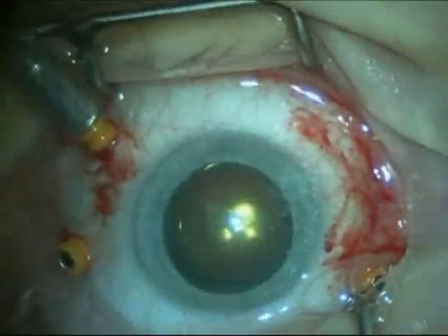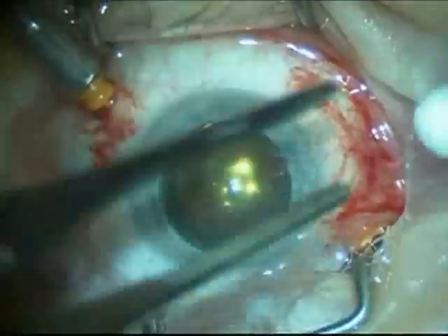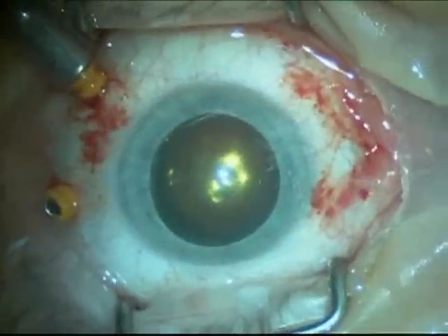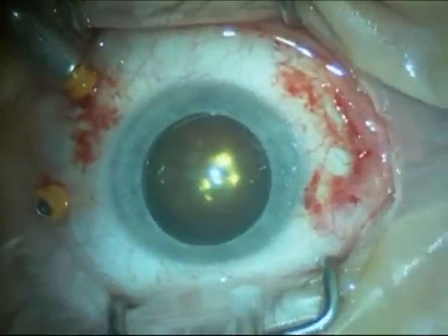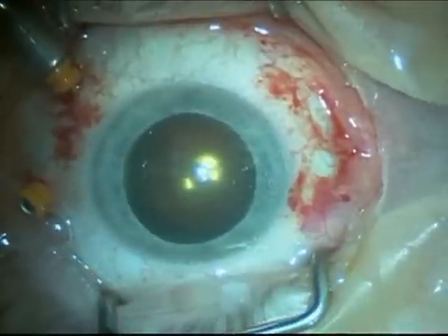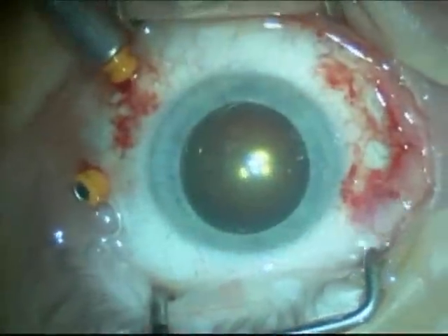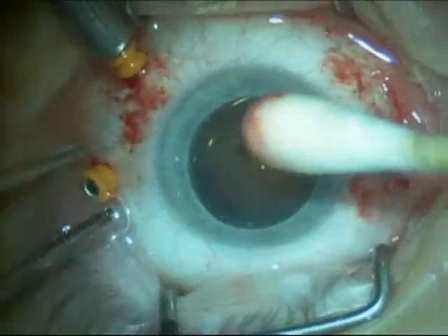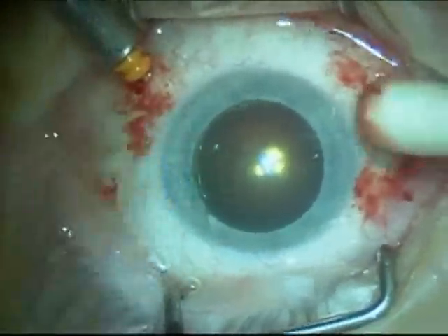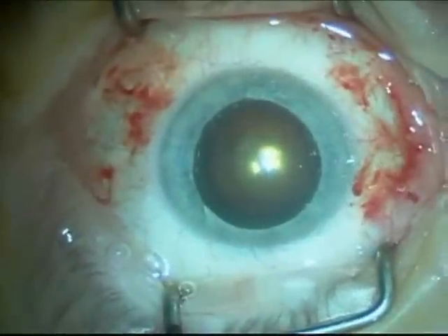Since the air only lasts about a week in the eye — not long enough to close the macular hole — we subsequently flush through a gas bubble which lasts longer and allows for the hole to close. There you see one of the trocars being removed, and now on the top left a special gas is being flushed through the eye. Once the eye is filled with the gas, the trocar is removed from the bottom left. A Q-tip is used to rub the incision shut, and once the eye reaches the proper pressure the final trocar has been removed.